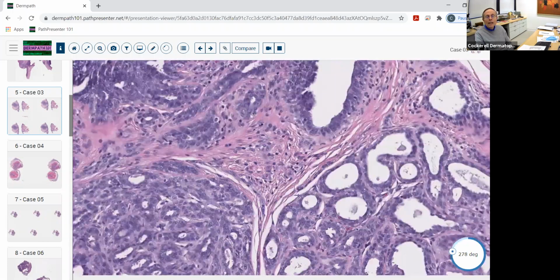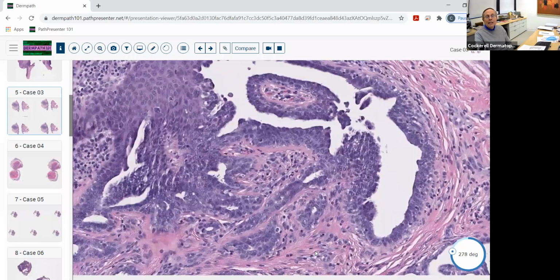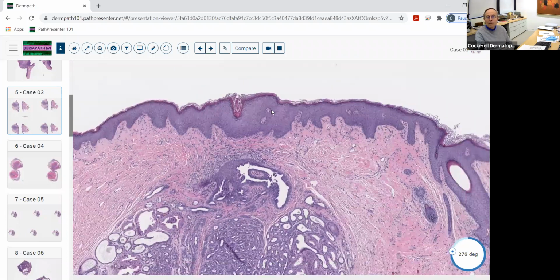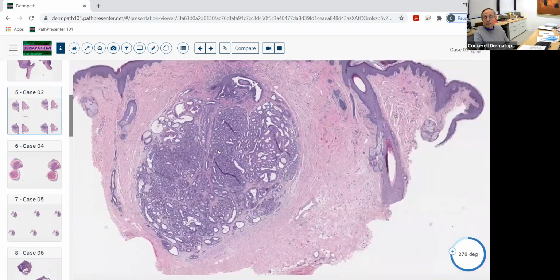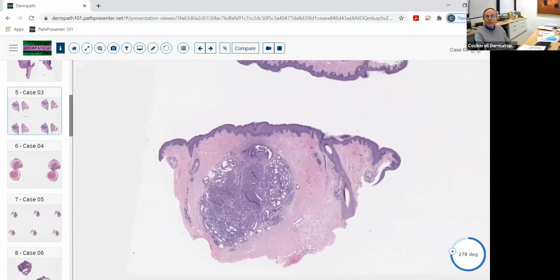So always look at the center of the area to see what kind of differentiation you're exhibiting. Look for the apocrine differentiation here. And this lesion is generally not contiguous with the epidermis, usually seen in a genital area. And there may be some lymphocytes and plasma cells up in this area over here. So that's the infiltrate that's commonly seen with it. So simple, right? This isn't a difficult, challenging field. You just have to think of it logically. So again, hidr, sweat; adeno means gland, and adenoma means benign tumor of glands with glandular differentiation. So hidradenoma, and then papilliferum, papillomatous, little papillae associated with it.